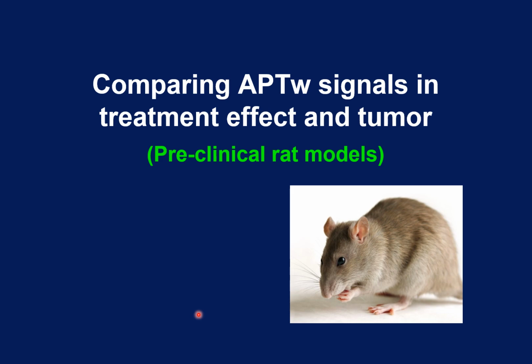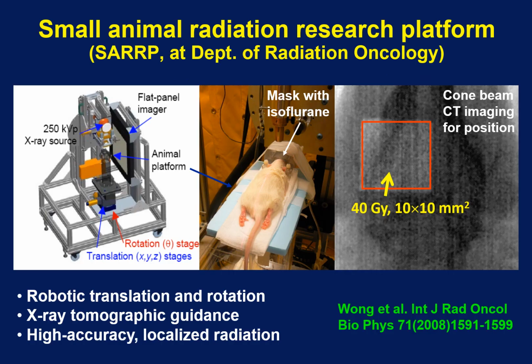We apply APT imaging to an animal model. So this is a very good radiotherapy equipment for animal study.